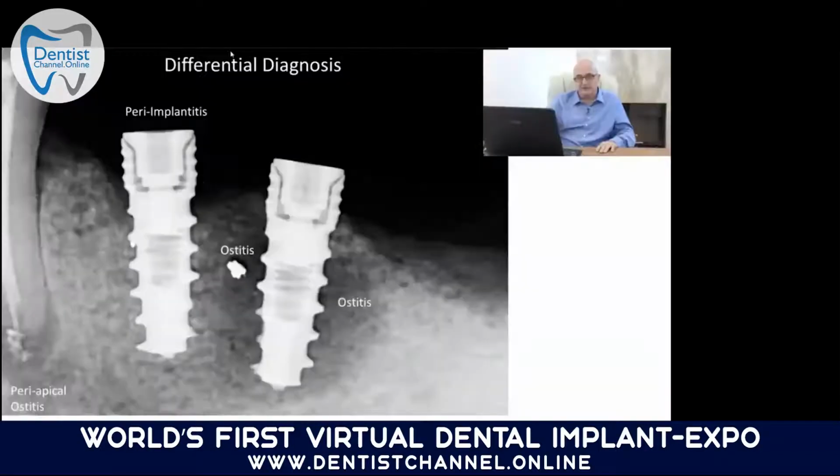This slide is about differential diagnosis. So you see two implants here. One implant has this crater-like bone loss that you see here. See, this is all soft tissue here, and this soft tissue is in contact with the rough surface of the implant. And the implant is, of course, at this stage already colonized by bacteria. These bacteria are producing their excrements, and this then creates pus. Also, bacteria are dying, soft tissue cells are dying. So this is what we call a very heavy infection around these implants.